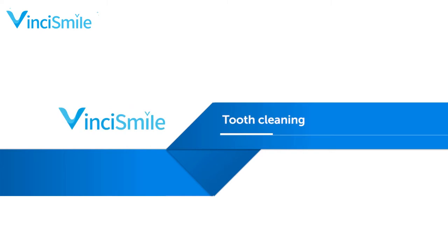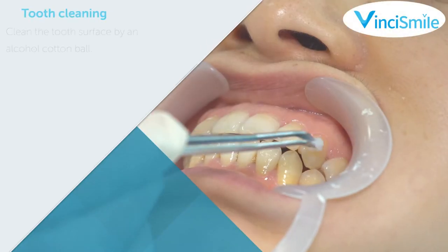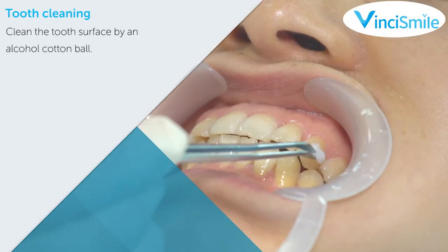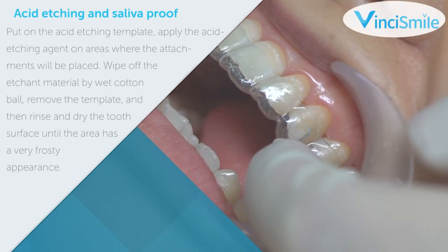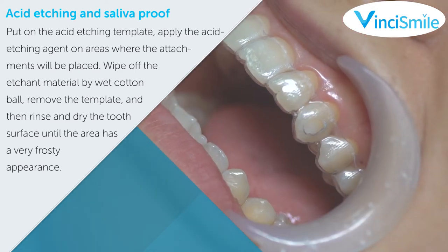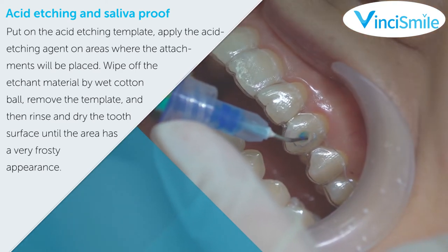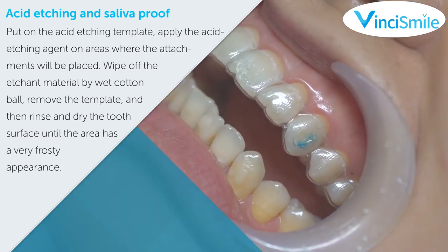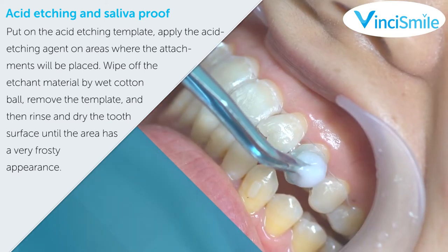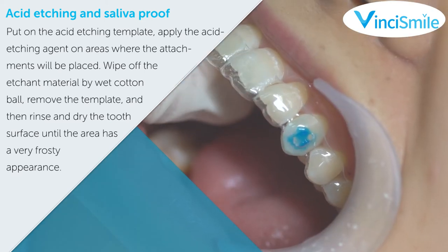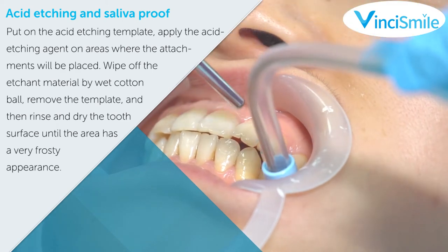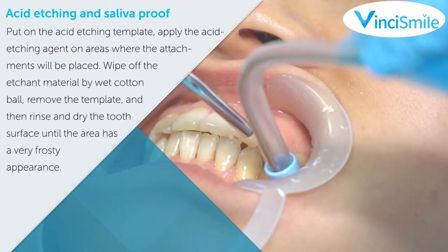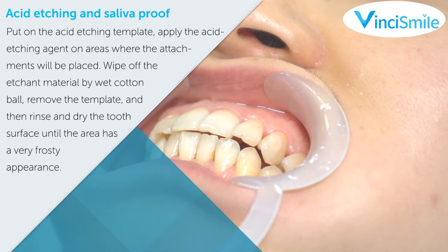Tooth cleaning: clean the tooth surface with an alcohol wipe. Acid etching and saliva-proof step: put on the acid etching template, apply the acid etching agent on the areas where the attachments will be placed, wipe off the etching material with a wet cotton roll, remove the template, then rinse and dry the tooth surface.